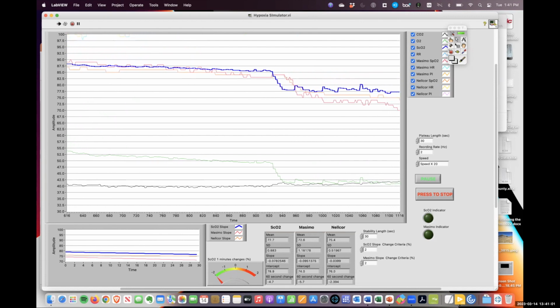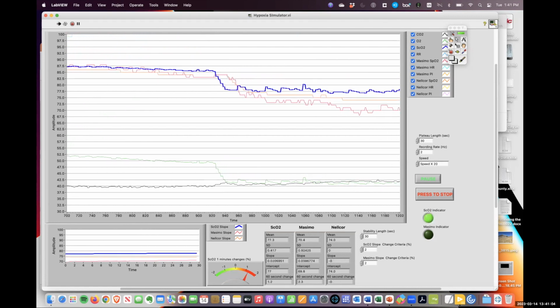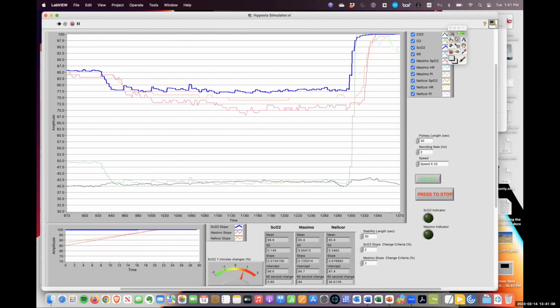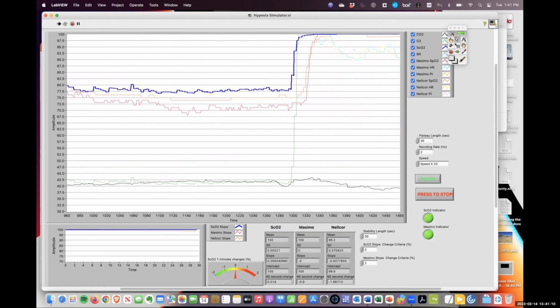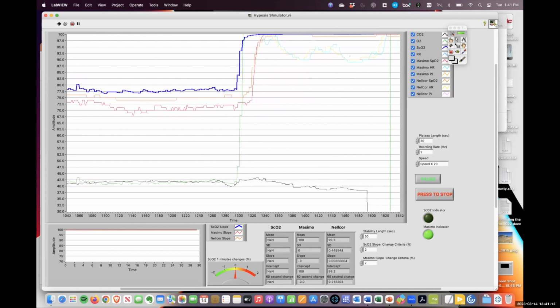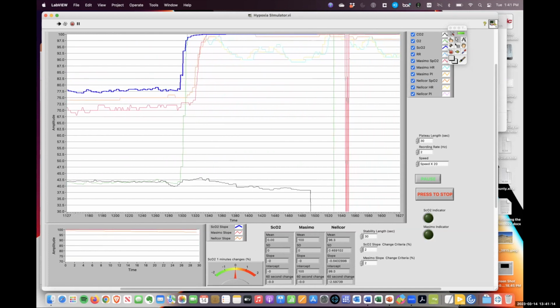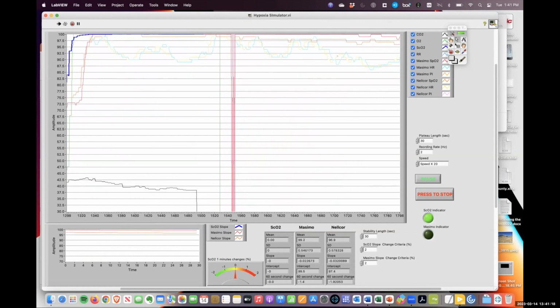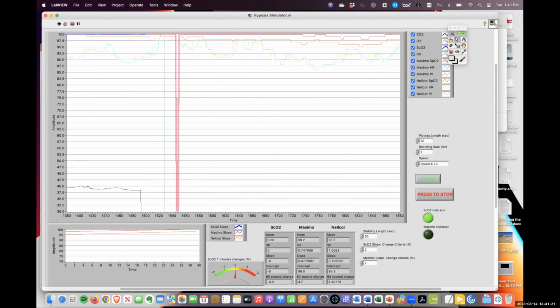And you can see the pulse oximeter. This is a very warm study subject, so we're getting good rapid responses, and then we resaturate, it comes right back up. Now you can see the heart rate coming down here. This person probably had a pretty vigorous hypoxic response. We have a little rest period, we catch up on blood gases, so we're not going too far behind.